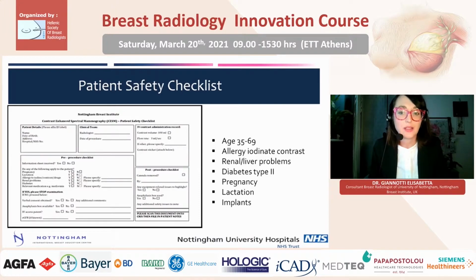We ask if the patient has renal or liver problems, or if she takes metformin for type 2 diabetes. In the presence of pregnancy, lactation, or an implant, we don't perform a contrast mammogram.